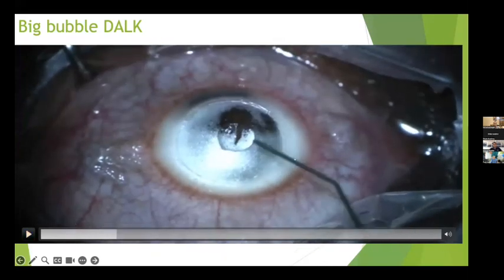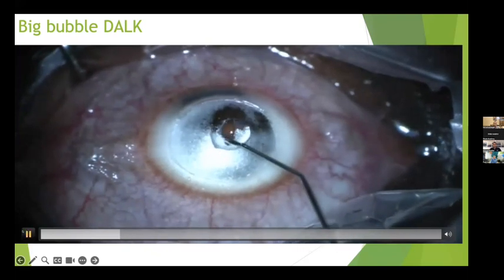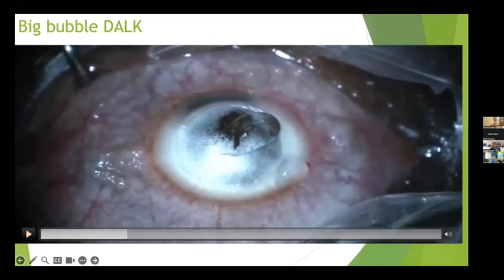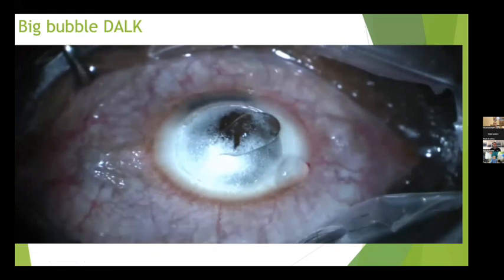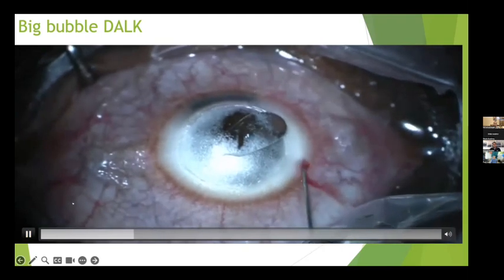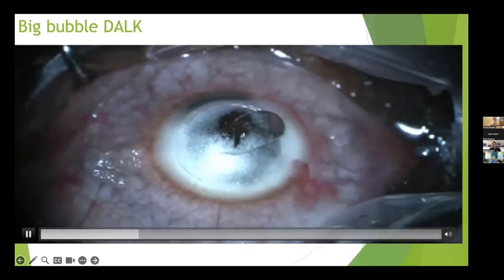We didn't make a side port paracentesis to release the pressure before the injection of the air bubble. I want you to see while injecting the viscoelastic here, because the bubble is under pressure, the viscoelastic just comes out. So essentially, as you can see, it's all about physical forces here. If you're trying to inject viscoelastic to dissect that plane, there is posterior pressure from inside, the viscoelastic will just come out, and there is higher chance of hitting the Descemet's membrane. While after creating a paracentesis and releasing some of the aqueous to reduce the pressure, now again, this is in slow motion.